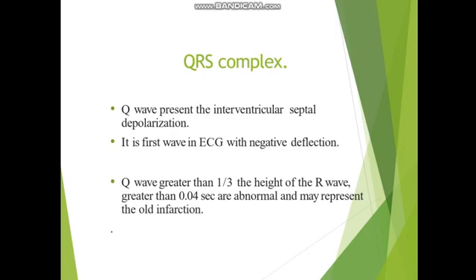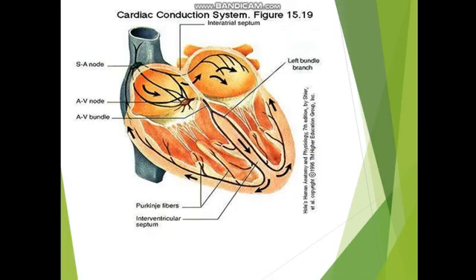Q wave greater than 1/3 the height of the R wave, or greater than 0.04 second, is abnormal and may represent an old infarction. This is the significance of the Q wave, I have already told you also.